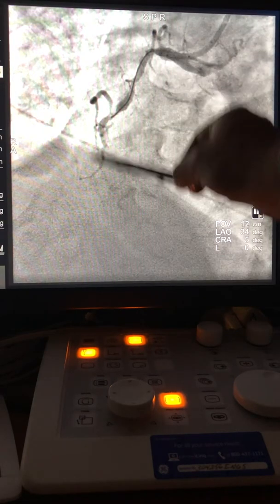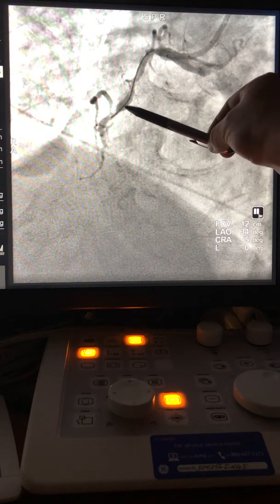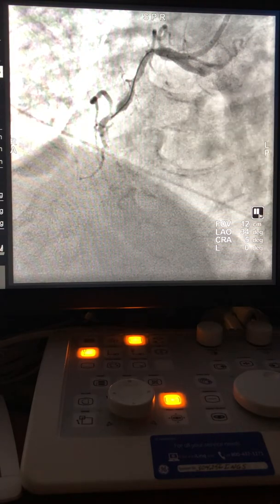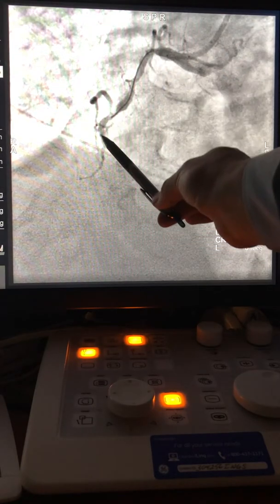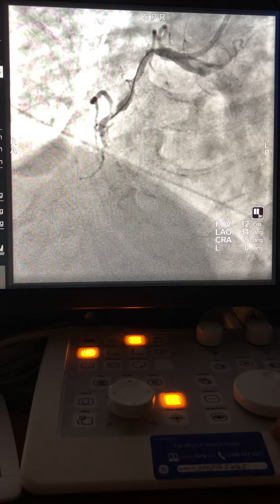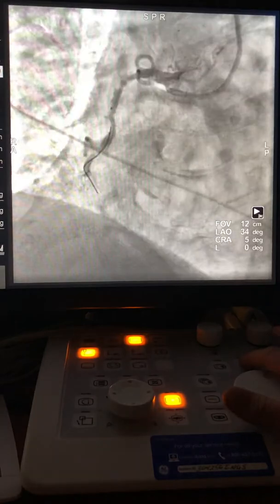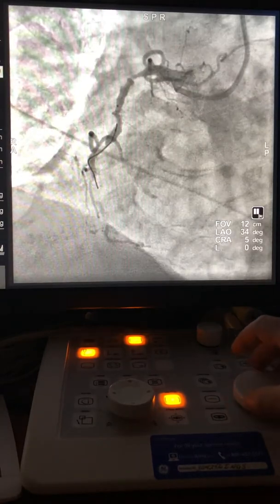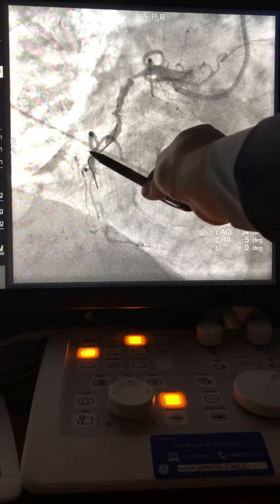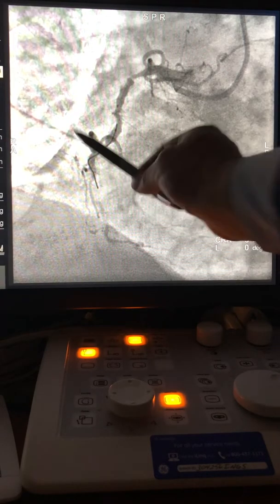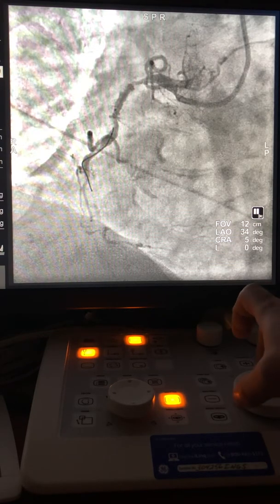You see the tip of the guide here — you'd expect some damping or ventricularization of pressure. First trick in this case: you might sometimes fix this area before you continue. In this case I don't have ventricularization of the pressure, so this is a run-through wire, always supported with a short balloon to pass it through. Here you see the short 2.0x12 balloon to allow the wire to spin and go to the right cap.